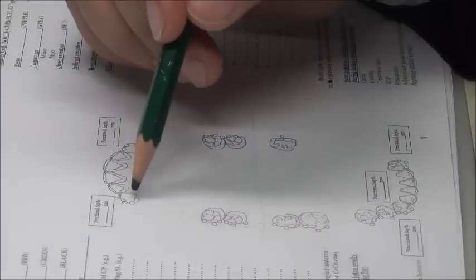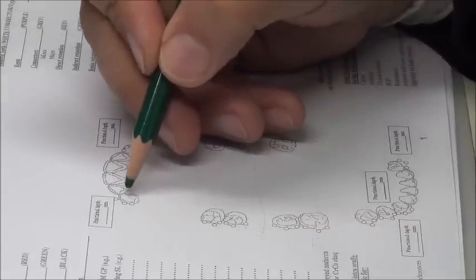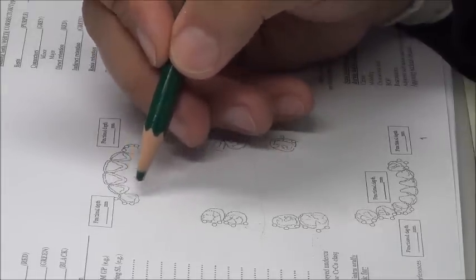In the major connector, did we change it? Palatal strap. Okay. The palatal strap can be left open away from the cingulum rest, or as we told you later on, fill it in with a plate. You're okay. Both options are valid. But once you choose a cingulum rest, and you don't want to put a plate on the tooth, make sure you really prepare your wall.